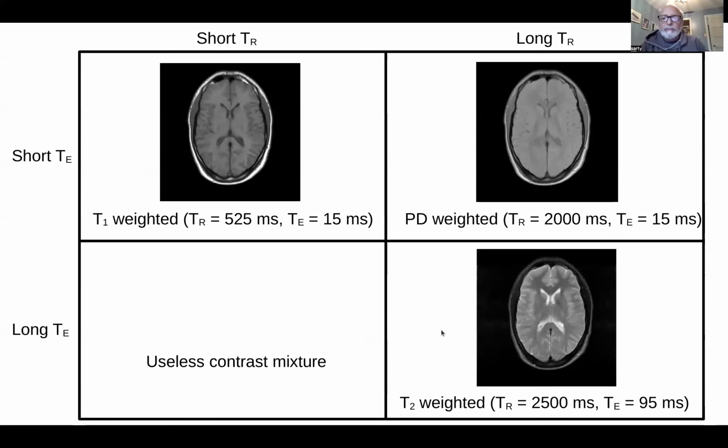So the preparation is the preparation of the spin system. Is that kind of where you're confused? And to get the contrast, all we do is we change the TR and the TE parameters in your pulse sequence. You just change those timing parameters. Is that what you're asking?